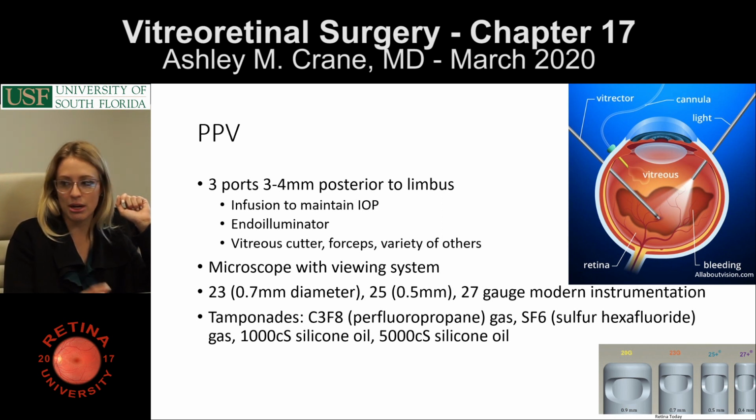It is hooked up to the vitrectomy machine, and it is supposed to maintain a constant intraocular pressure with its various sensors. There's also another port used for endoillumination, the device called the light pipe, which goes through another trocar. And then there is the vitrectomy instrument, and that's the third.